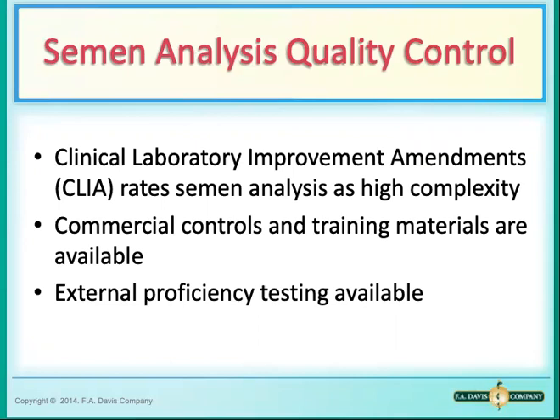And lastly, the evaluation of semen is, as always, subjected to quality control. So it is very important that we use control materials when we're doing this overall analysis. And I know that there is some subjectivity associated, especially when you evaluate motility and morphology, because there's really not a lot of control in terms of that, and it's going to be subject to what the person is seeing.